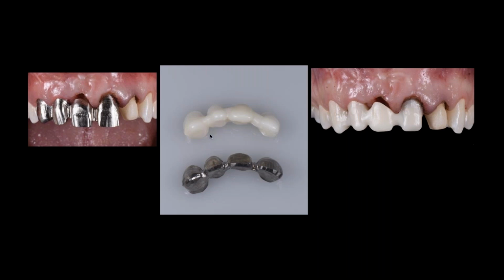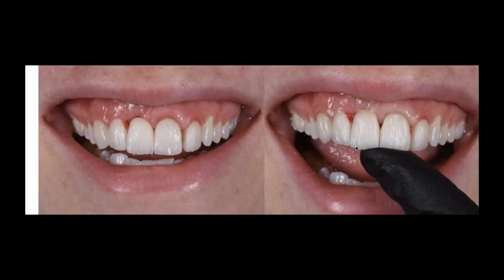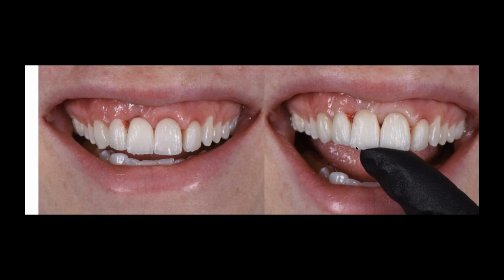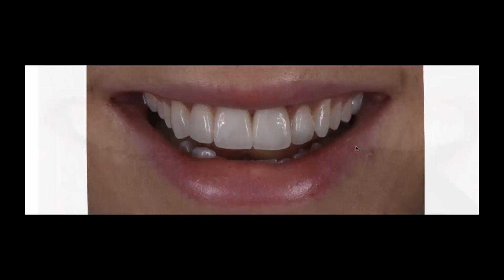We did make a metal ceramic frame and a zirconia ceramic frame, and I actually built them both up, and we tried them both in, and I hope you can't really notice much of a difference between which one is metal and which one is zirconia, although you probably can. The metal ceramic is on the right of your screen, where the zirconia ceramic is on the left of your screen. And then in the end, we're going to finish this up.